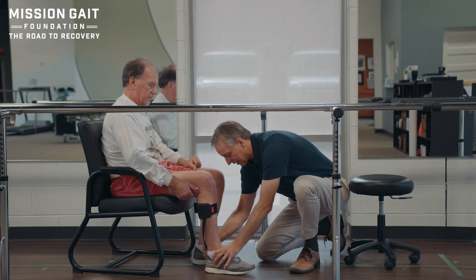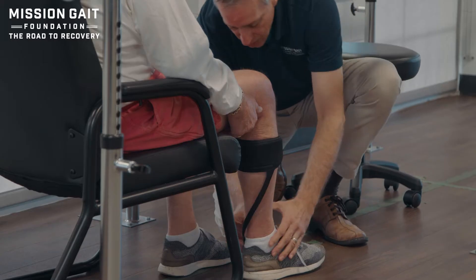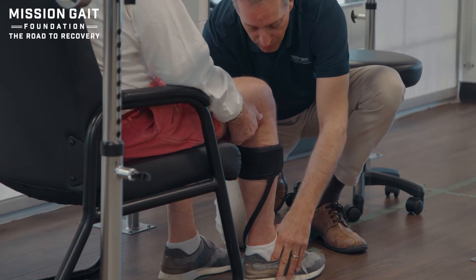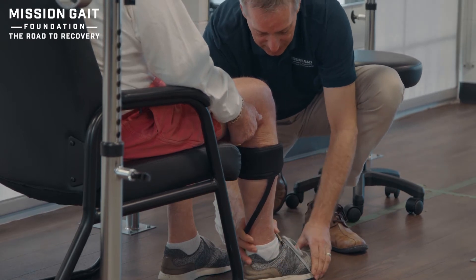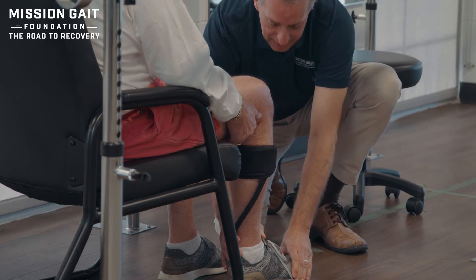I'm going to take a look at it, make sure that where the bars are, there's nothing catching or pinching on the patient. There's no pressure into the arch or problem where I can see a rub. Nothing in sitting - generally the length looks okay.